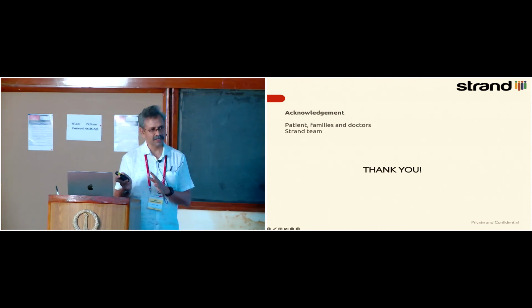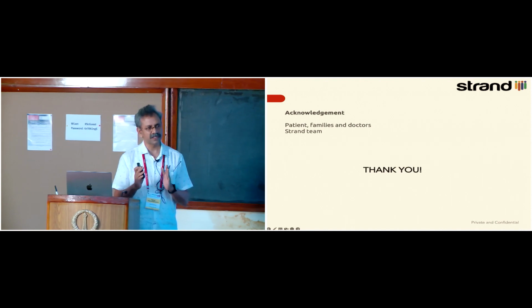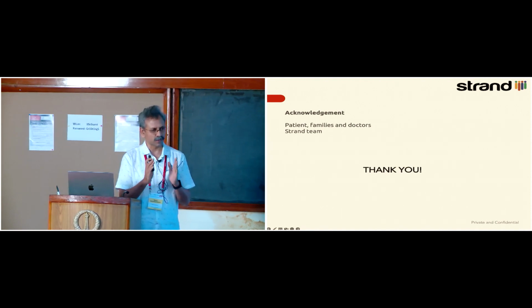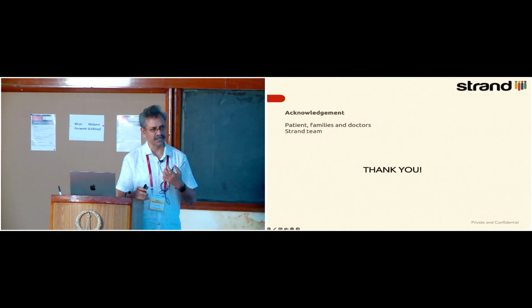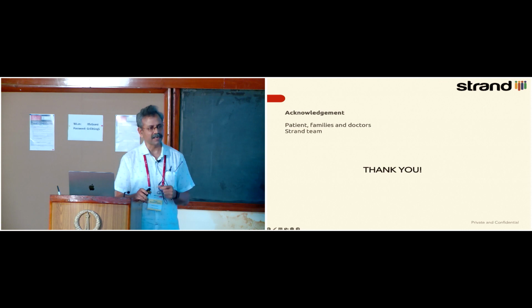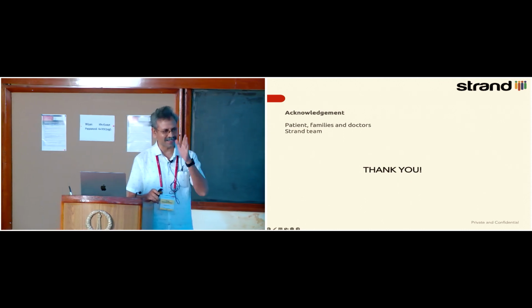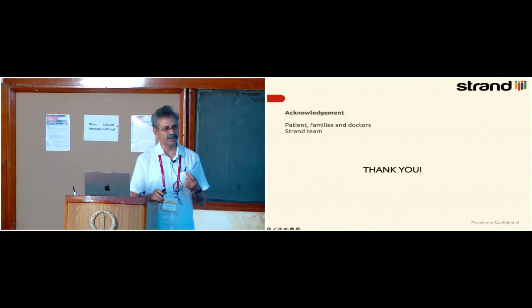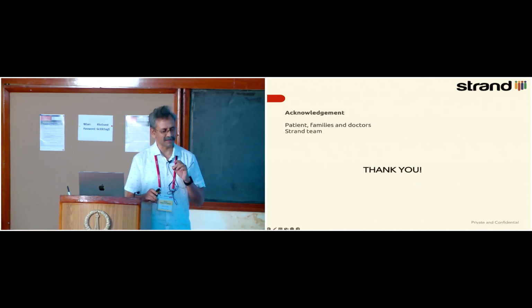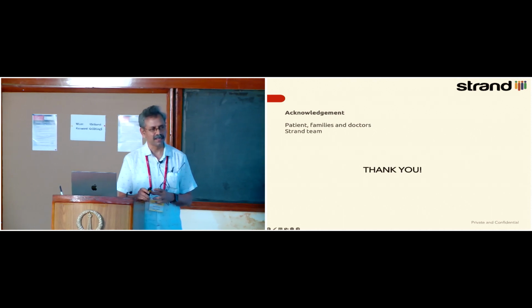In this particular case, we were able to verify it because it was a 10 exon stretch, but where we really struggle is when we see a signal in 1 exon or 2 exons: is that noise or not? You need a huge amount of data to control the variance at that level of detail. We have even reported on a case where there was a half exon deletion. That's because the doctor had an inkling that it might be that gene, and we went and looked at it, but otherwise we would have just missed it through routine processing.